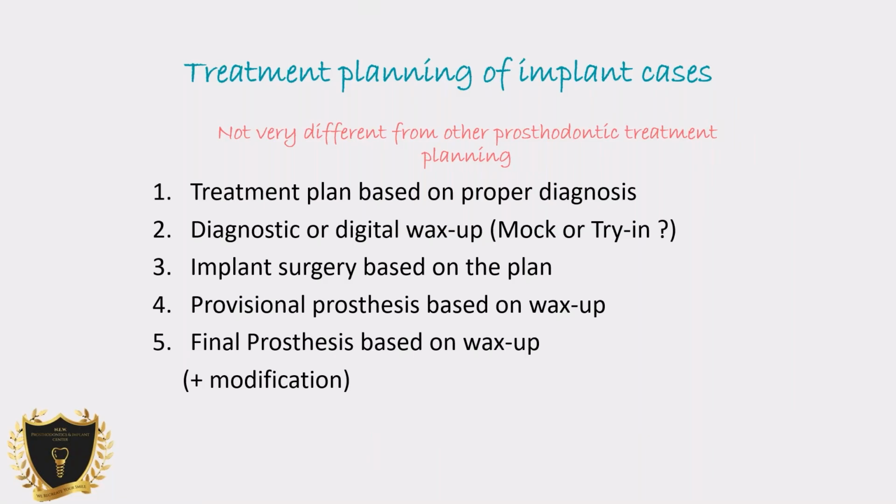And as you're executing, you may be able to print your prosthesis or mill your prosthesis or fabricate a temp if you're loading it immediately, or once it heals, you can make a provisional prosthesis and then use this as a mock or a digital blueprint to optimize your final results. And that will all be possible if you plan the case ahead of time and then go with a crown-down technique.